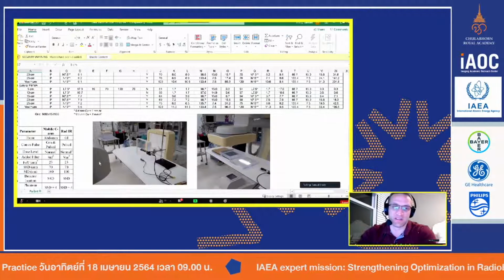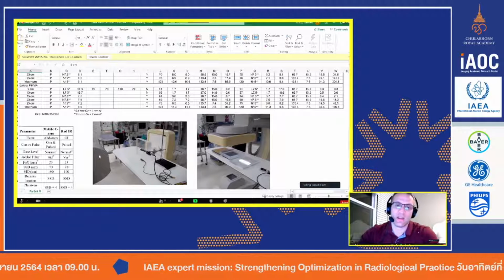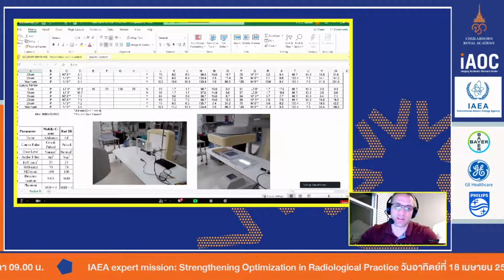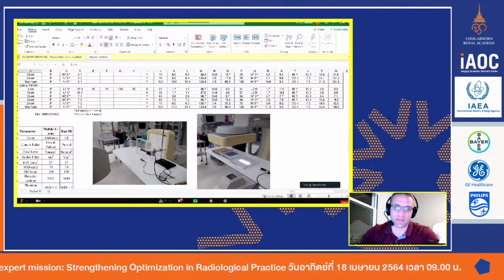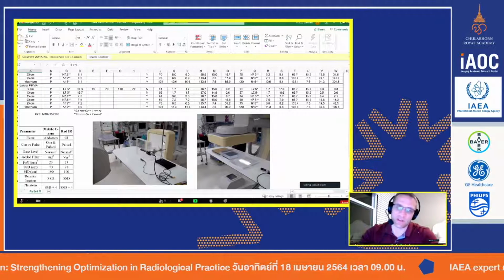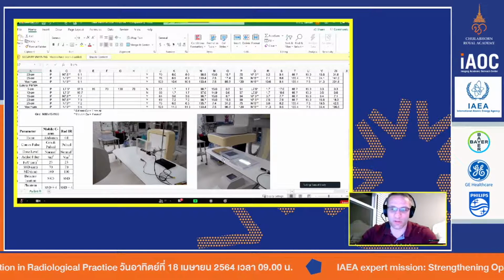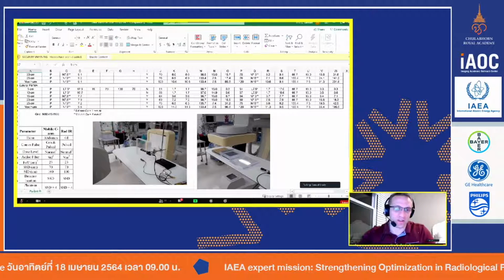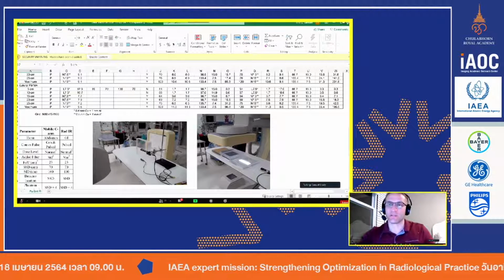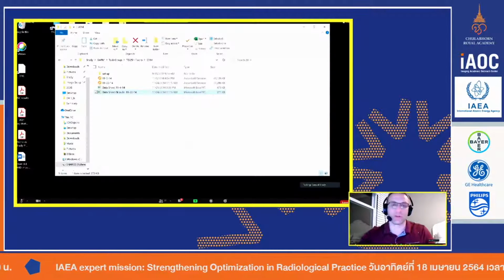But here you can see this is another of my interventional systems. Once again, I've got my blocks. Because the geometry is different, I had to test it both laterally, because obviously you can use the system laterally, and in the anterior-posterior direction through the table. So these blocks are pretty handy. You can do all kinds of crazy stuff with them. My apologies, I really should have included that in this talk, but I will put that in next week.